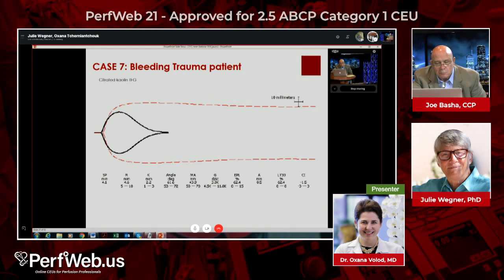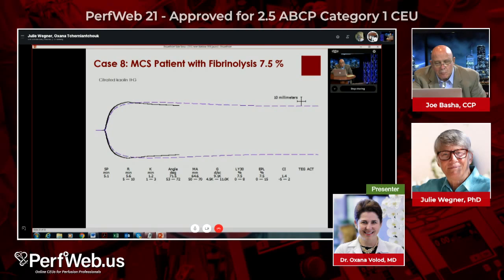And again, in liver disease, you also want to be careful with antifibrinolytic therapy. But this is the treatment of choice in situations like that. So again, the diagnosis would be primary fibrinolysis. Now, this is the third type of fibrinolysis. So let's look at this particular TEG.